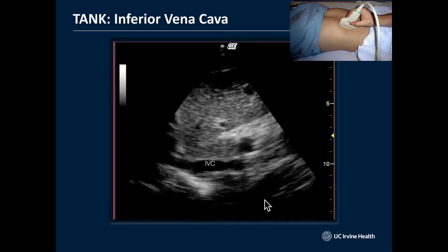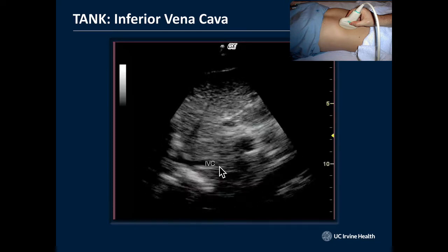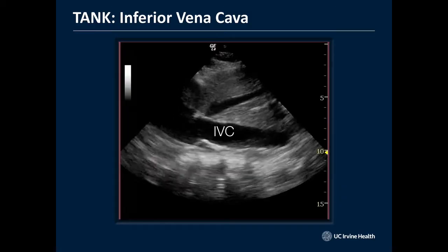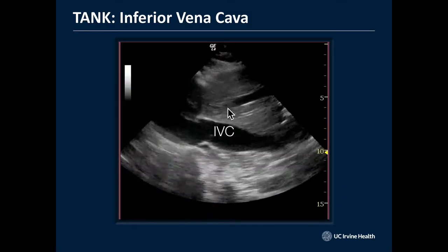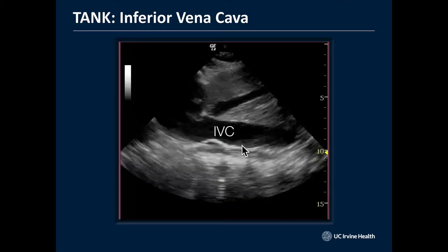Now, this patient here definitely has a flat IVC. See how as she's breathing in, boom, the walls of the IVC almost touch here and there. It's small to begin with anyway, so this patient definitely needs some fluids. This patient, on the other hand, has a plump IVC. You could almost call it plethoric, another term to describe that. In fact, here's the hepatic vein, and the hepatic vein is even dilated. This patient has so much fluid on board.